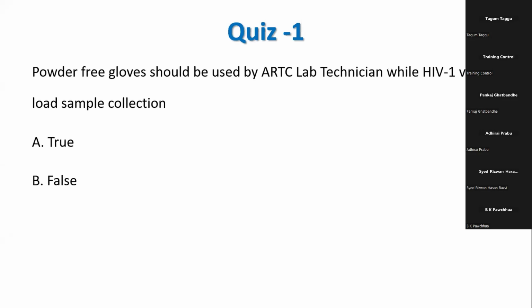So I would again emphasize this point that powder-free gloves should be used for viral load testing. The reason why we are asking you to use powder-free gloves is, if you use powdered gloves, and that powder goes into your blood sample, it mixes and stays in the plasma, and that plasma will go to the machine in the lab. While testing, the machine will not give you a correct result, it will not generate a report, it will give an error code.